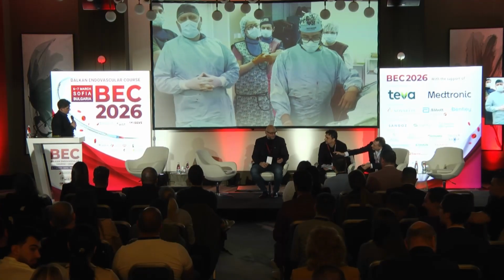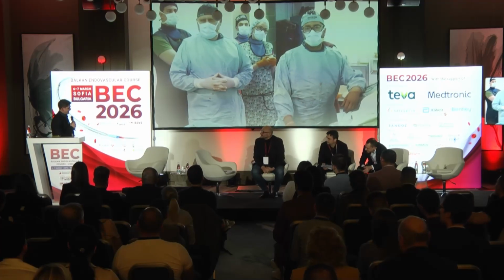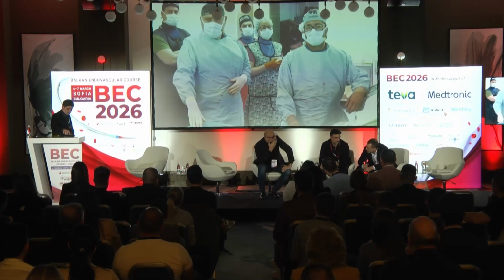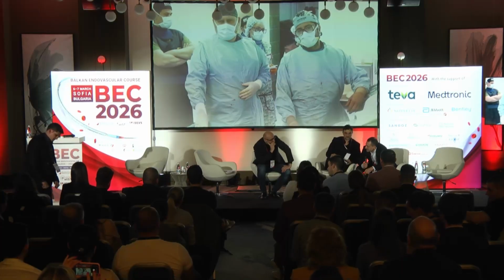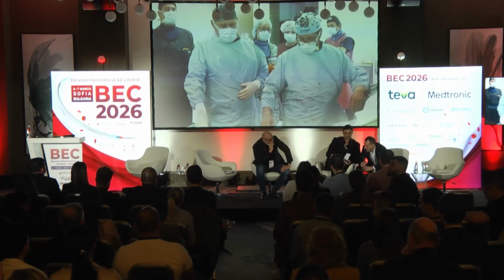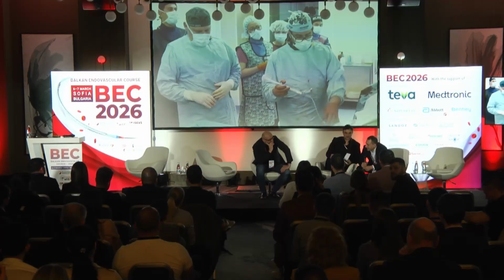Yeah, okay, Venovo stents are nice. My boss will tell you more about the choosing of the stents because it's his presentation actually. Well, nowadays it's a question of money. We still have only the Wallstent reimbursed in our country, and all the other stents are too expensive. So some patients can afford these expensive stents, and in that case we can use Venovo or Abre.